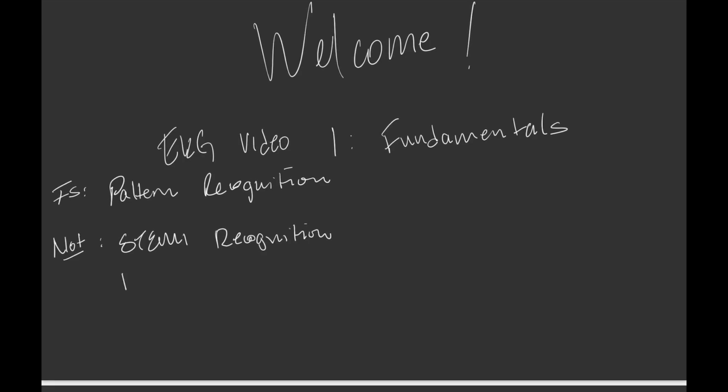Furthermore, it's not a basic interpretation video. That's to say, there should be a solid understanding of millivolts and milliseconds and how many squares those are, and how to determine if something is a sinus rhythm or a junctional rhythm, things associated with ACLS. Right? Those skills you should be relatively comfortable with prior to coming into this video series.